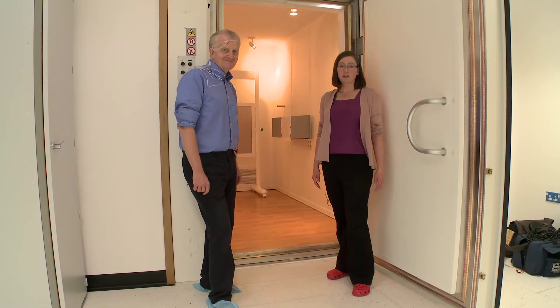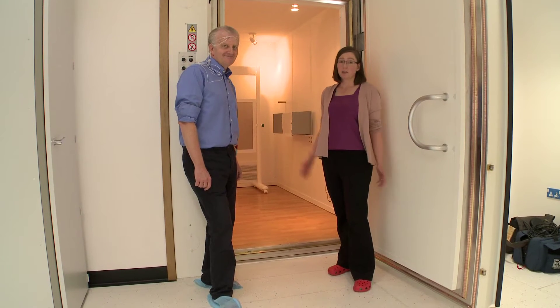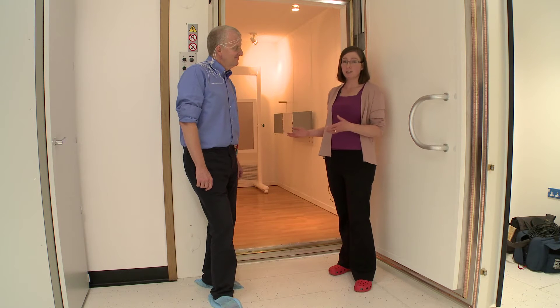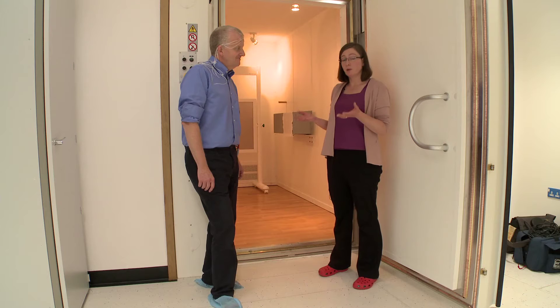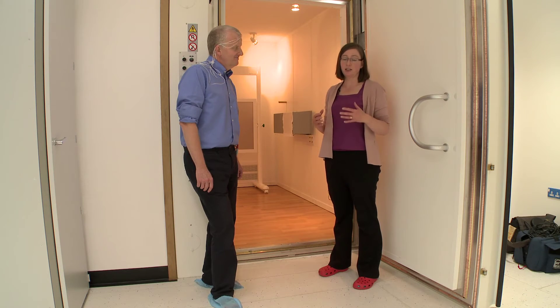The MEG scanner is inside this room. I'm going to take Stefano through, ask him to take a seat in our chair, and then slowly lift him up so that his head is inside the MEG scanner.